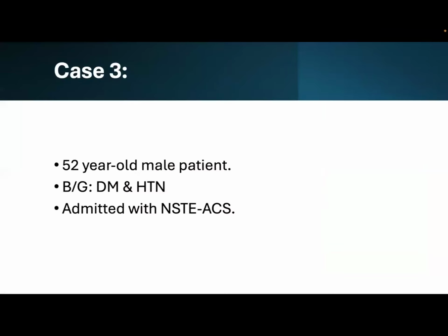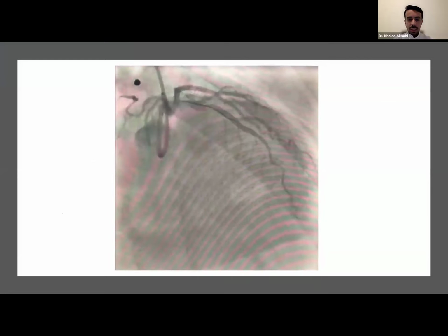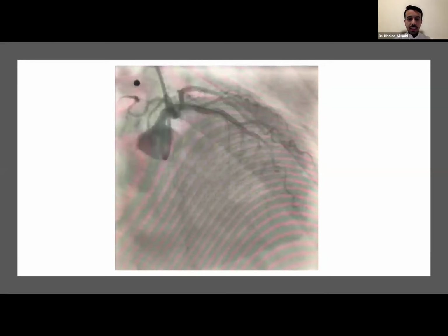Khalid, would you tell us what is the length of the stent? What is the actual size when you implanted? So this is a 3.0 by 44 Nagomi stent. So we just post-dilate with 3.0 distally and 3.5 proximally.